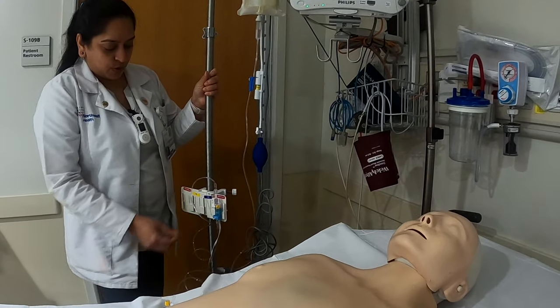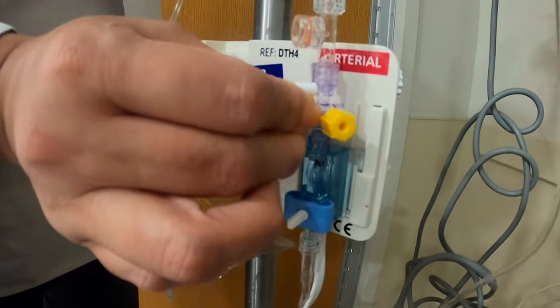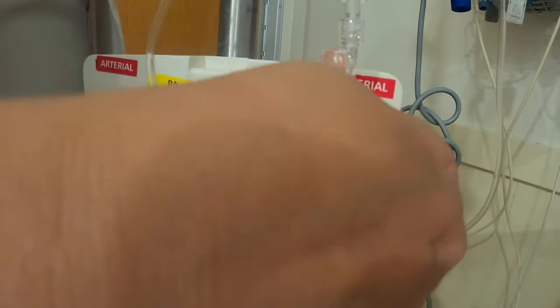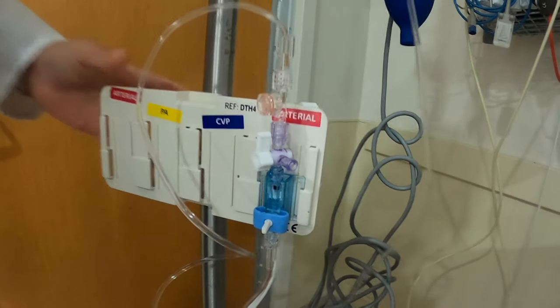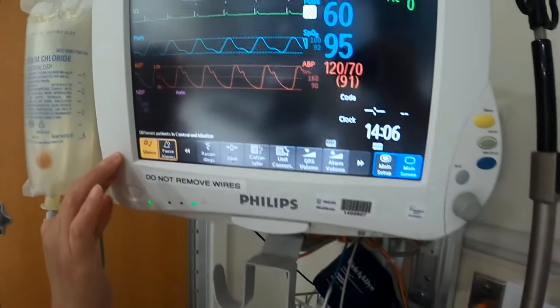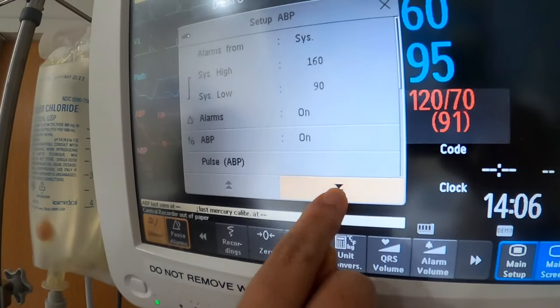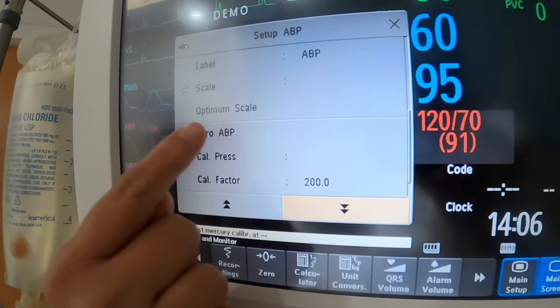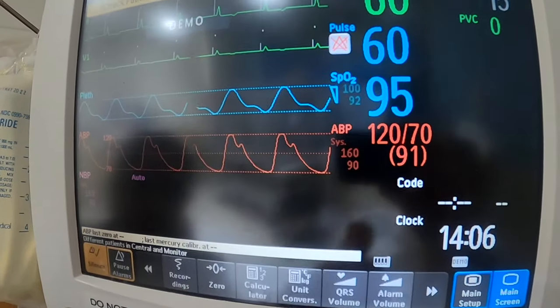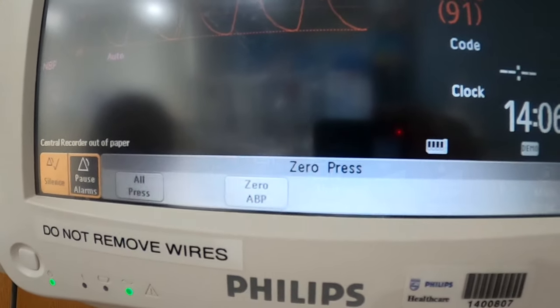To zero, you need to turn the stopcock off to the transducer and open to air. Once you do that, on your screen you can zero. You can tap on your arterial line and zero ABP by pressing here — that's one way to do it. Another way is to move these arrows and press zero right here.